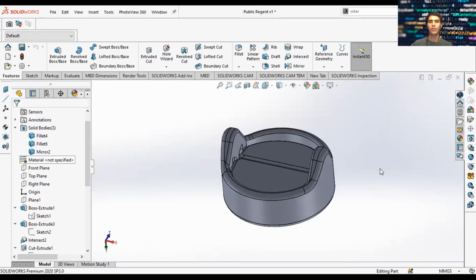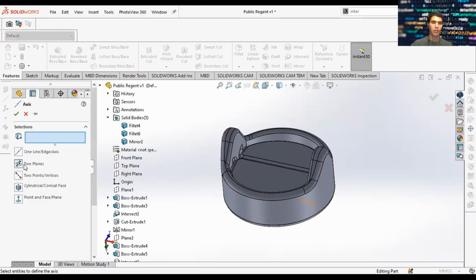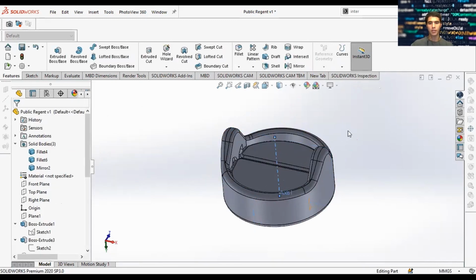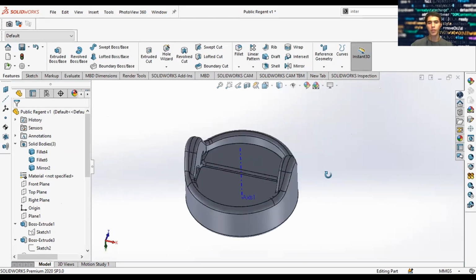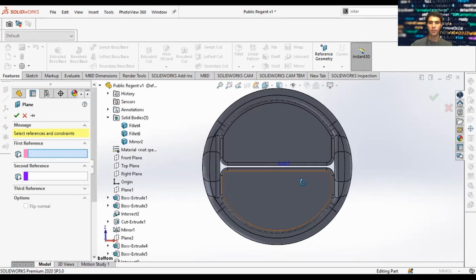And so the cuff is going to allow for the mechanical valve to anchor to the tissue. And I think the cuff goes around it. So what we'll do is we'll experiment with angles. Right now we have our main planes, the front and the right plane. Let's go ahead and add an axis between two planes, the front and the right plane. And with this axis, we can experiment with the angles of planes that we could add.